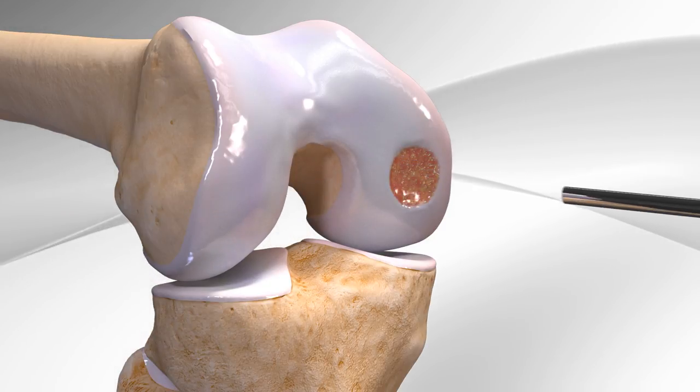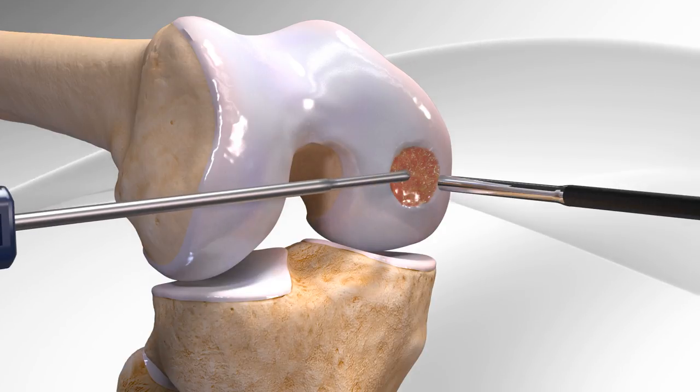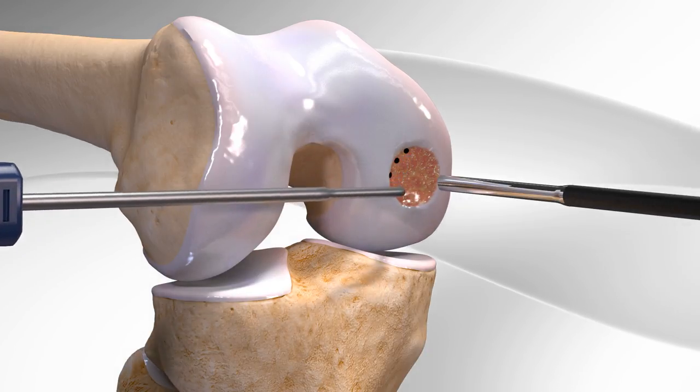In this procedure, the surgeon makes the surface even and multiple small holes are drilled in the bone to help promote the healing process.